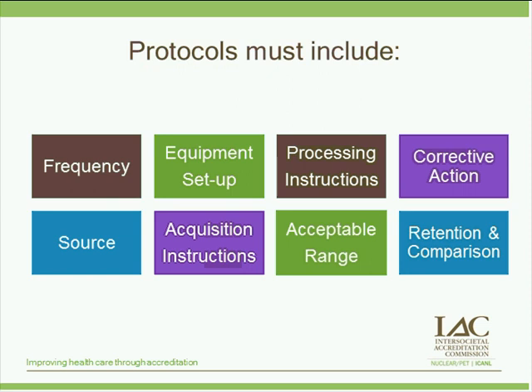Equipment set up to include things such as whether it is an intrinsic or extrinsic test, the collimator, energy and window settings, matrix size, zoom, acquisition instructions, including the views and time per count, processing instructions, such as, if applicable, region of interest placement for quantification or sinogram generation or graphs, evaluation and acceptable range or tolerance limits of the results of each procedure.